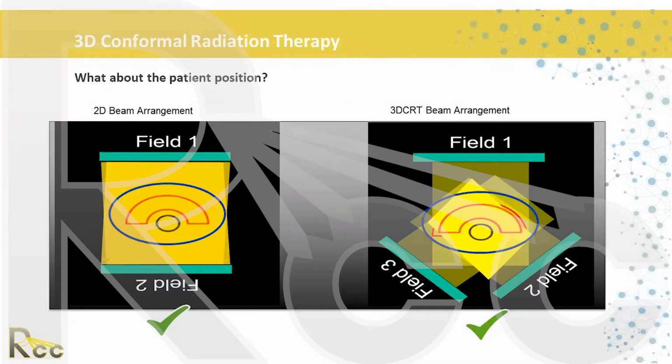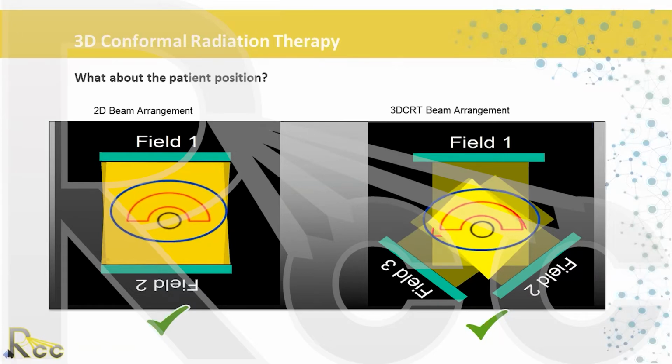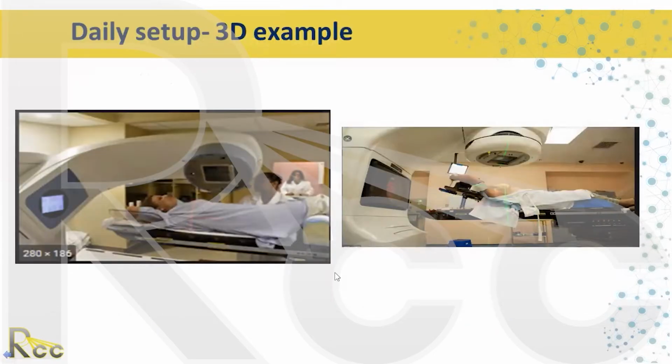Sorry, I'm just going to go back to the last one. I wanted to note that it's also important if you're doing a breast and superclav that you check the superclav and you make sure their head is turned.